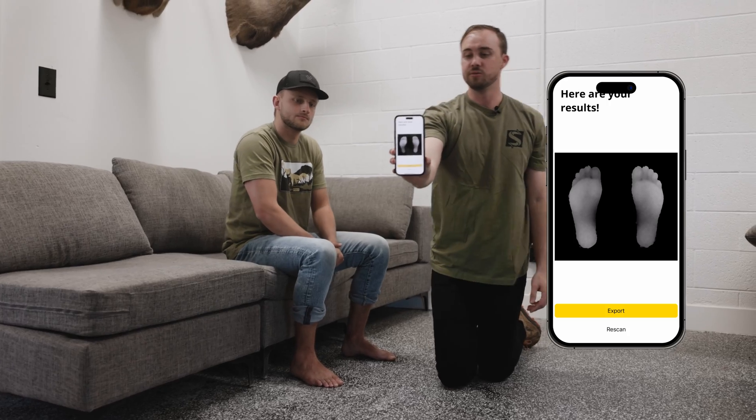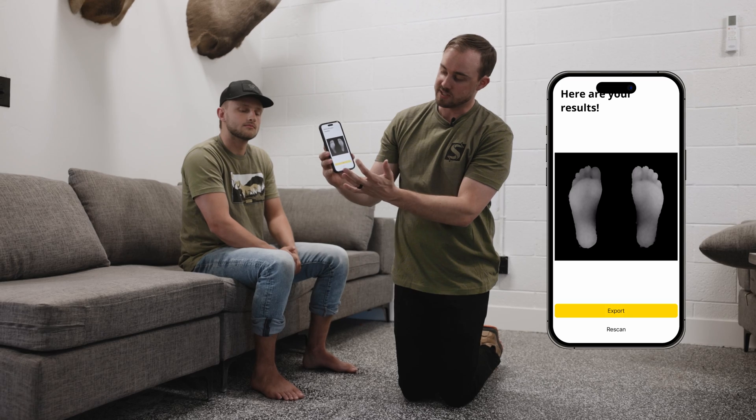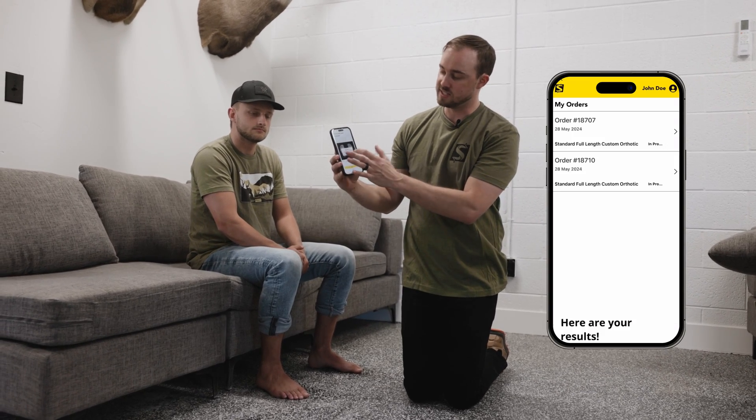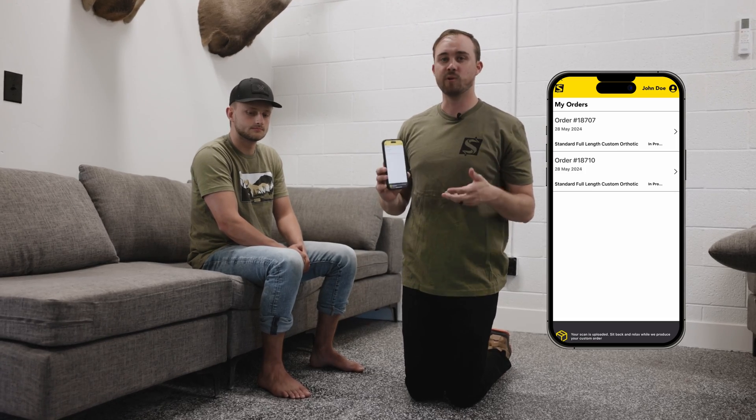Once you have both feet scanned, press export. It will upload and show 100% success — your feet are uploaded and that's it. You're completely done and we can get your order going.